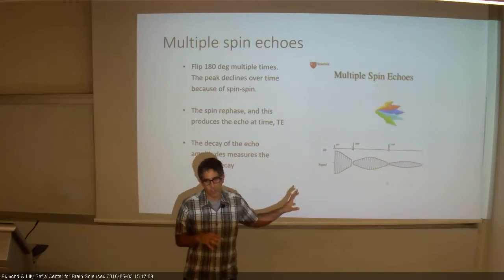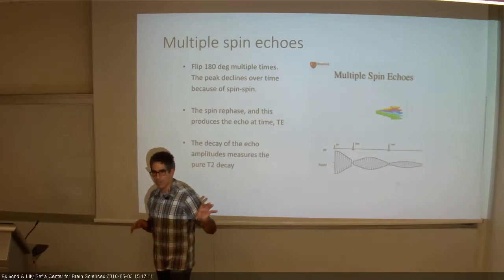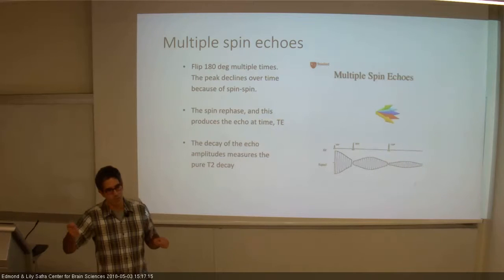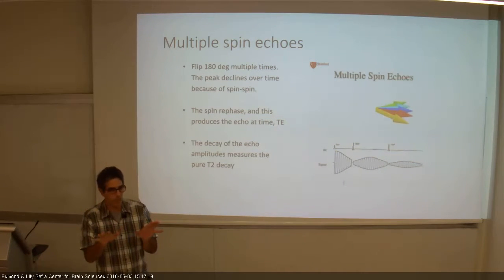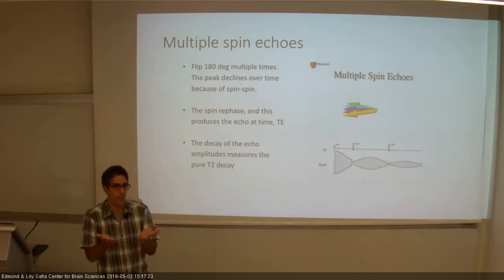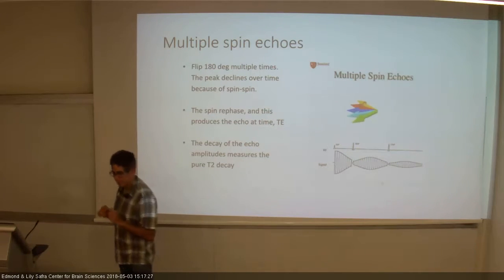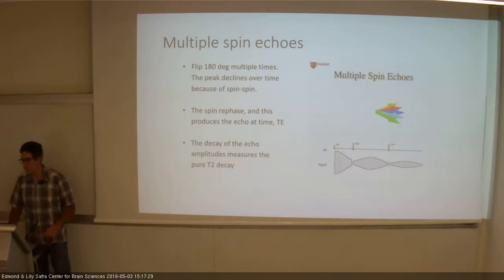So spin echo is a way to measure T2 because we kind of remove the effect of T2 star, or T2 prime, and stay only with the T2. The effect that comes from the T2 effect, this flipping the spin with 180 cannot cancel that. That's lost. And so we have a measurement which is T2 dependent.